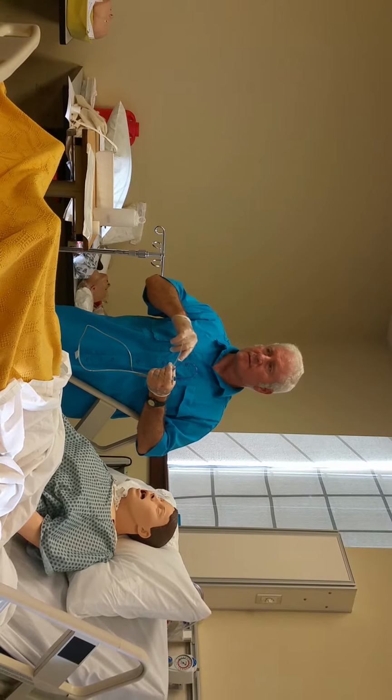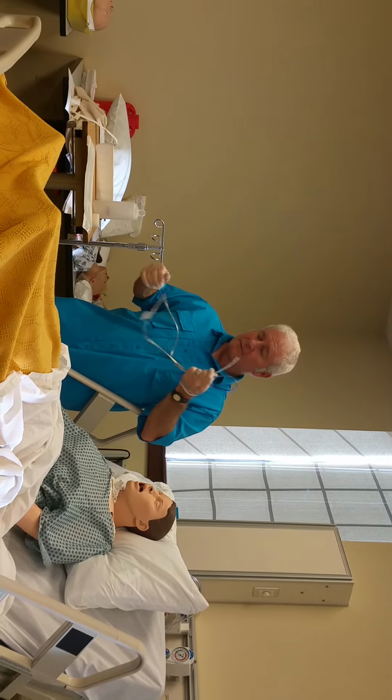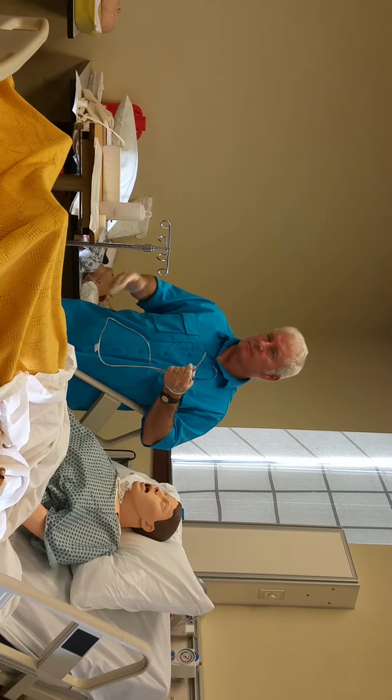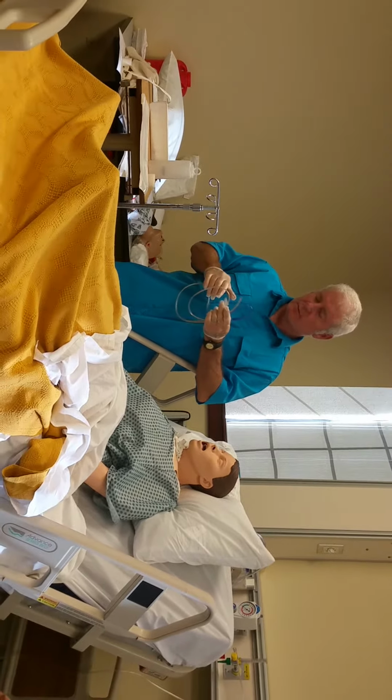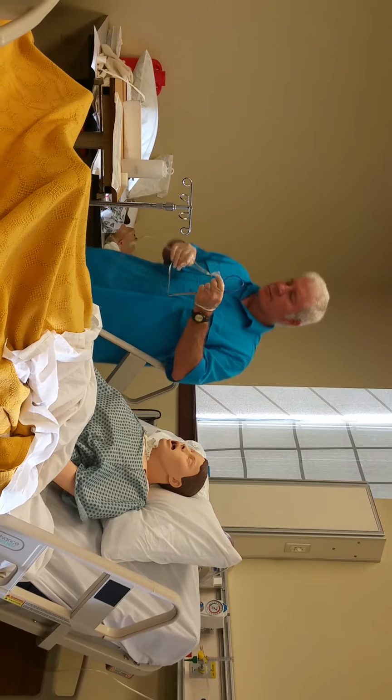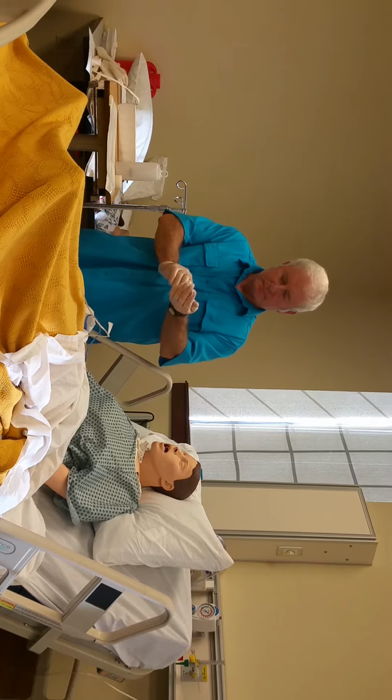So make sure you always flush it, and then for feedings, you always aspirate. It's called measuring the residual, okay? You always measure the residual, and then make note of that, okay? So, any questions about that?